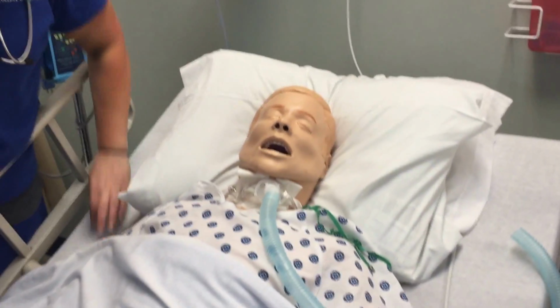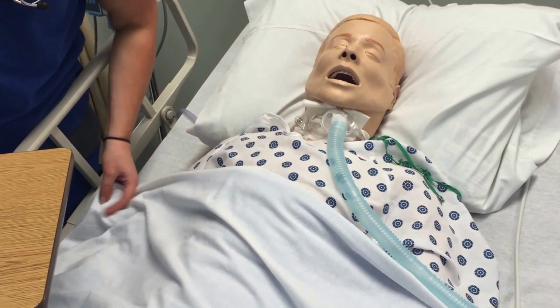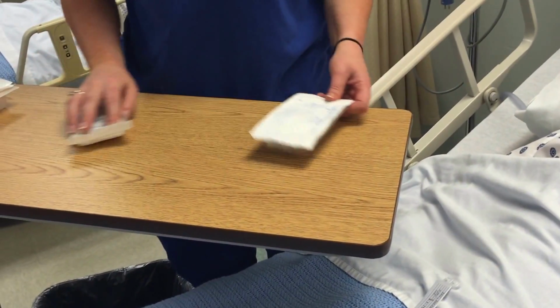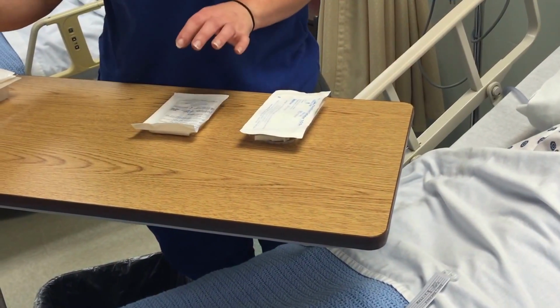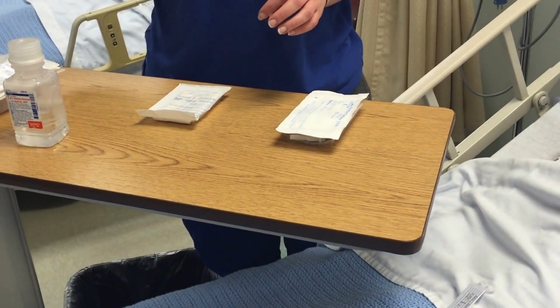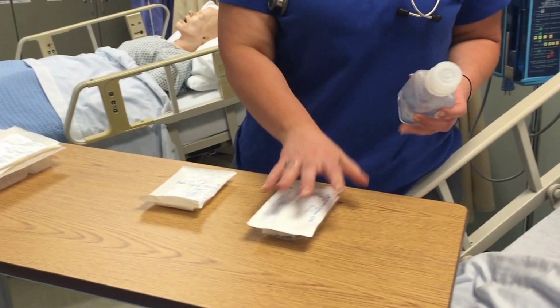All right. I'm just going to have you take some deep breaths, just slow deep breaths, just regular breaths for me while I get everything ready. Okay, Miss Dan? Thank you. Doing okay? Yeah. And of course, patients may not be able to vocalize, but you can still communicate with your patient. All right, so here I'm going to be using my normal saline for the suctioning.